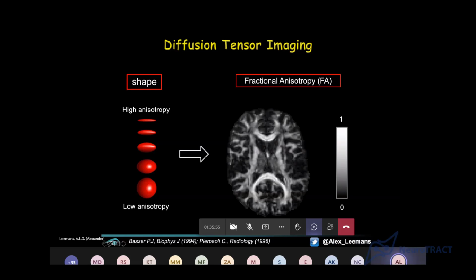But obviously in practice, we don't show these ellipsoidal maps. All these ellipsoids, that's not convenient, right? It would take too much time for a doctor to really understand and look at all the little details. It's kind of cumbersome. So it would be more convenient to have maps, just images.